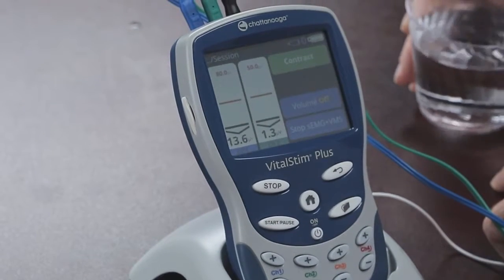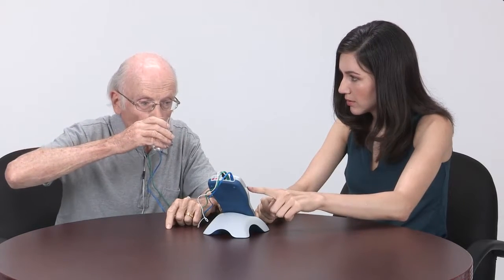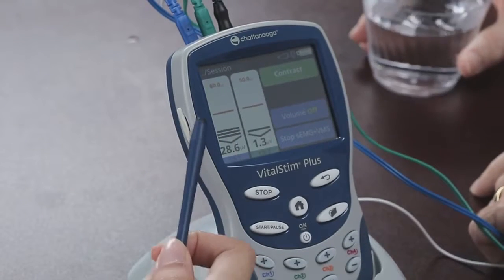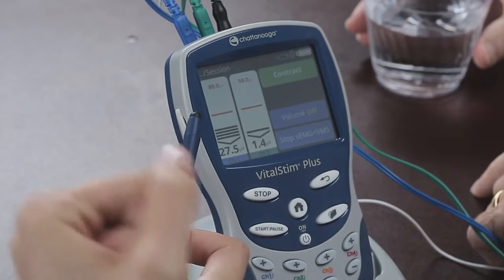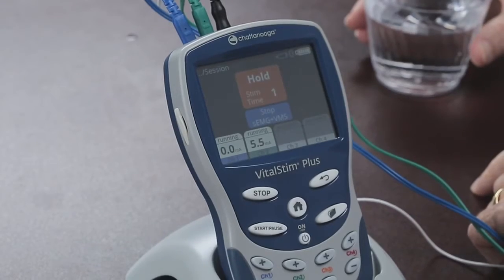When you get the swallow going, try and put in a big effort to reach the threshold. When you reach the threshold, hold it and hold it and hold it for the right amount of time. Once this is done and executed, the patient repeats this cycle as many times as is therapeutic. And this concludes this video tutorial.